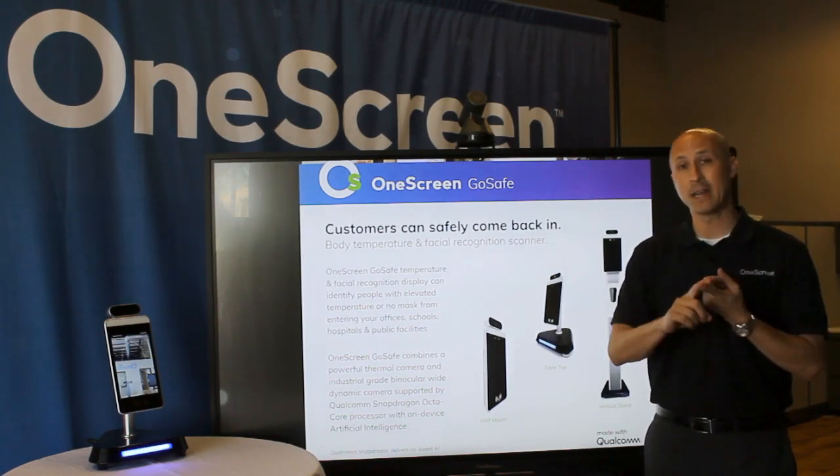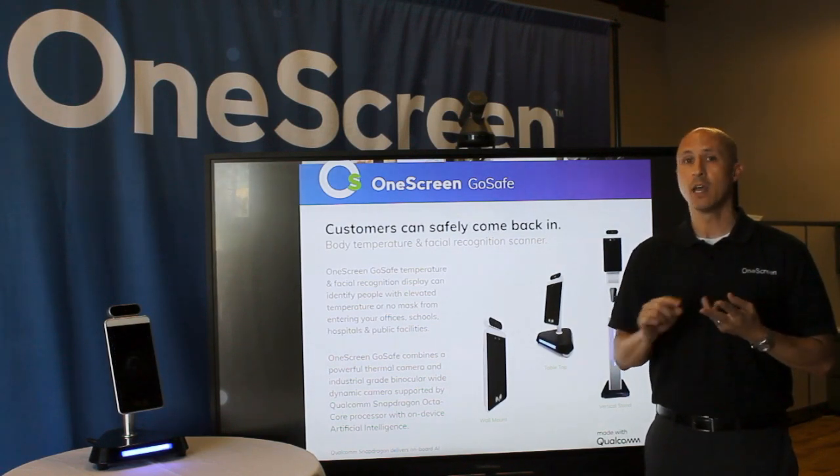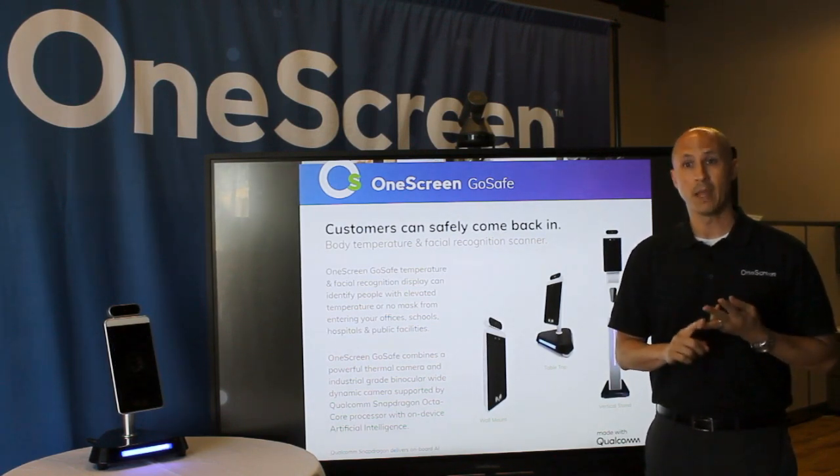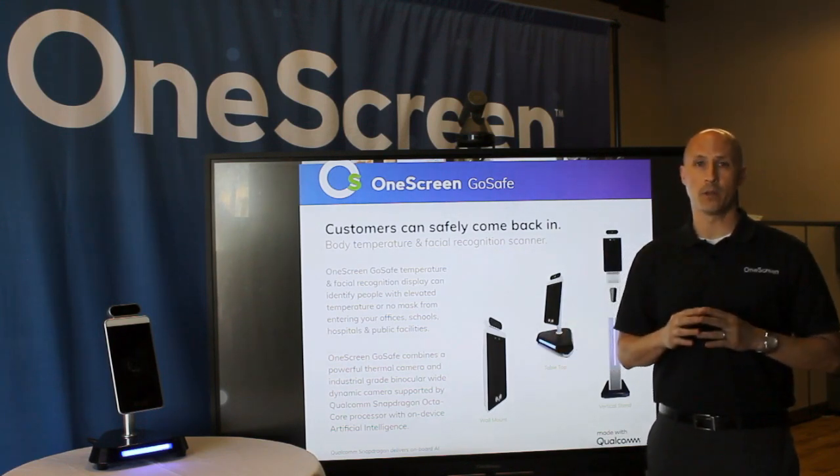This device has the ability to body temperature scan and do facial recognition scanning with or without a mask. You can even do ID cards as well. And when all else fails, you actually have the ability to connect with the receptionist to open the door for you.